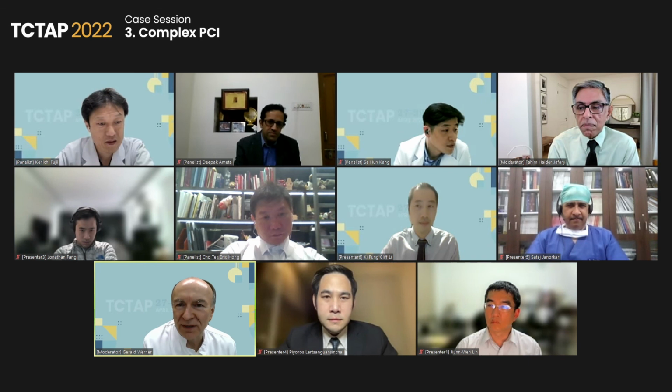No, I don't think so. If I look at the angiogram, it's not a good idea to try the rotor ablation. But he used the cutting balloon, which is also somewhat dangerous. But nothing happened after the cutting balloon, so nobody knows what would have happened if he had used the rotor ablation. It's really difficult. But when we look at the angiogram, this patient could have some chance of coronary perforation. That's why we should not use the rotor ablation first. We should try the balloon first in this case.